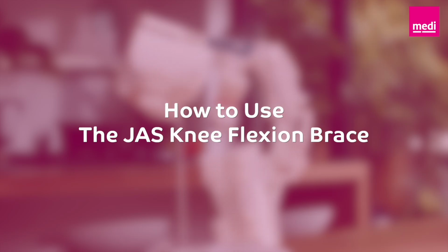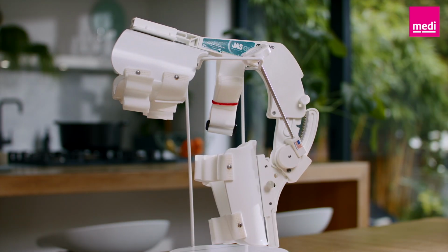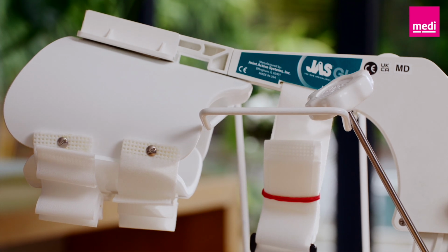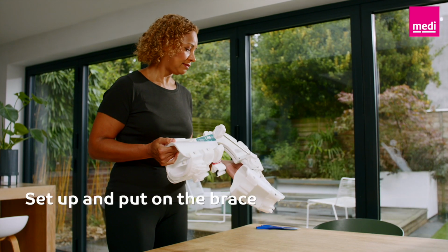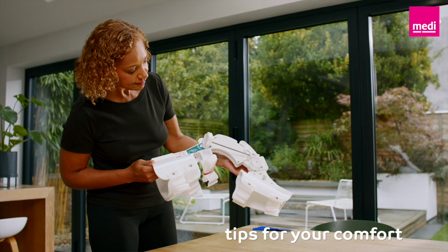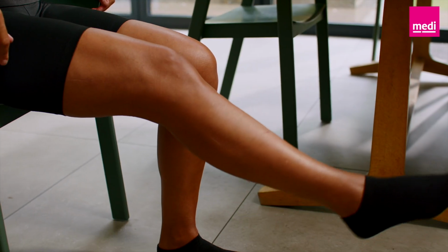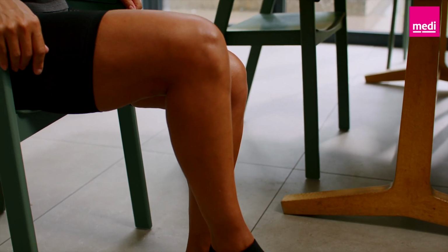Welcome. In this video, we'll guide you through using your JAS knee flexion brace to help improve bending your knee and reduce stiffness. You'll learn how to set up and put on the brace, go through the JAS therapy session, and get helpful tips for your comfort. By following these steps, you'll get the best results from your treatment.